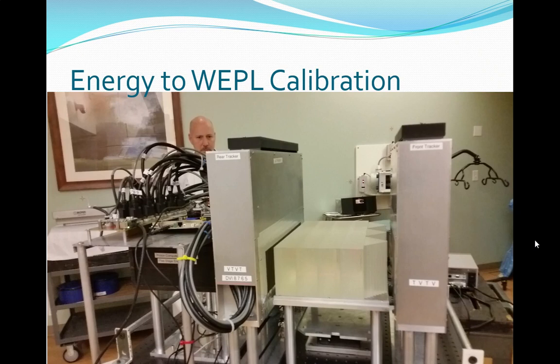As an interesting note, see these look like a stair step? So these are stair steps, because our original thought was, let's just get a whole bunch statistically at certain energy ranges. That actually ended up causing artifacts in the final image. Because what had happened is we very precisely got certain points, whereas when we smoothed it out, so the new ones are all smooth, we get a spread.